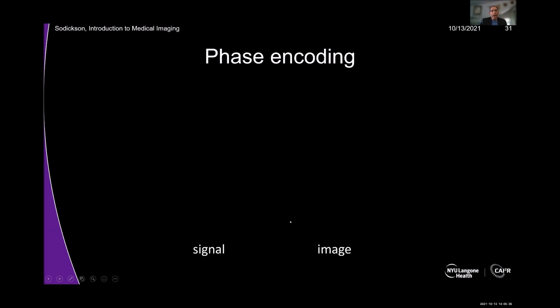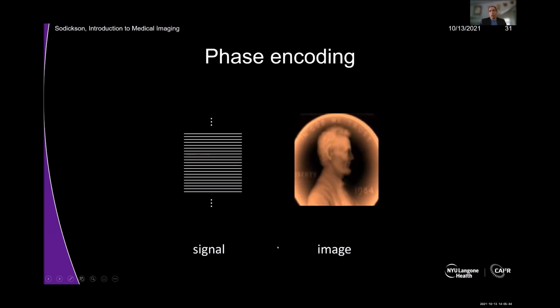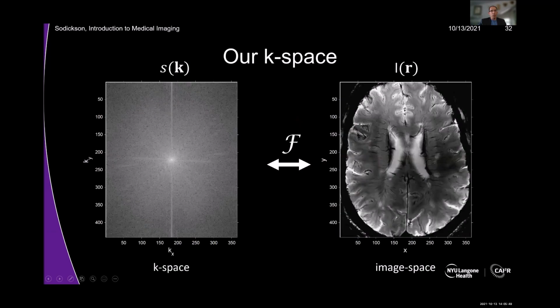So if we were to add in each new phase-encoded line and accumulate the image, which is not what we do, but is useful for visualization, then you can see, just as you saw in Urvashi's animation, the information in the image is building up spatial frequency by spatial frequency until you get a nice sharp image. And if we now organize all of those lines of data into a nice matrix with frequency encode along one direction and phase encode along the other, we get our K-space, which is the Fourier pair of our image, but it's also the complete analog of the radio astronomy K-space.